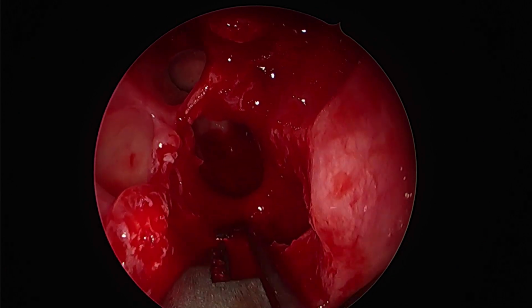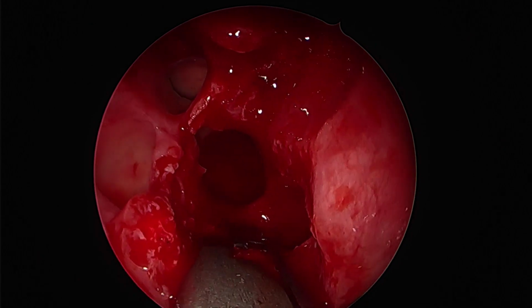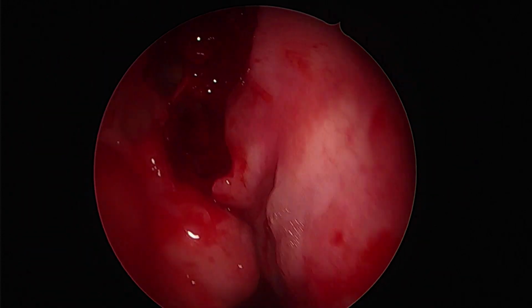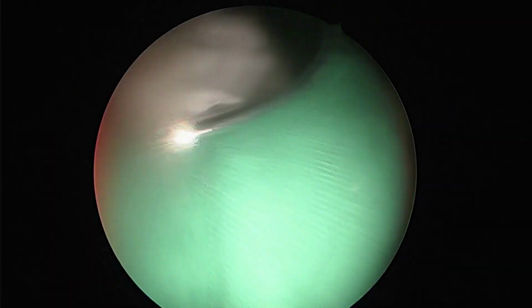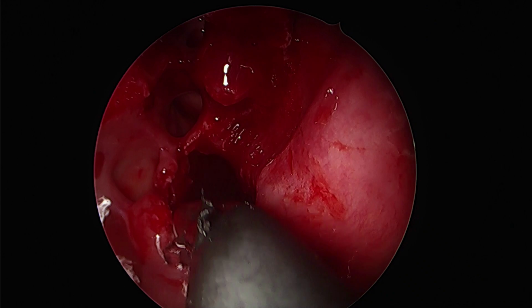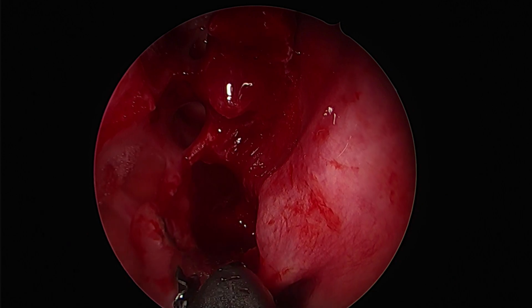Once getting rid of the excess mucosa, we can see some more bone, which we'll be taking off. So we'll be using the coagulator again to achieve some hemostasis onto the raw mucosa that we have created with the microdebrider.